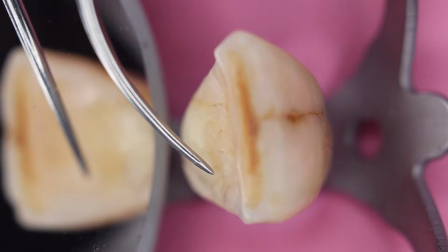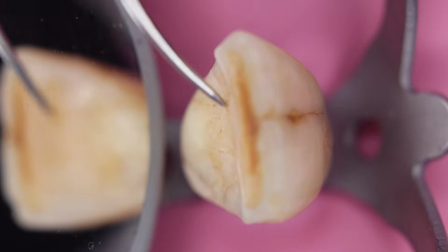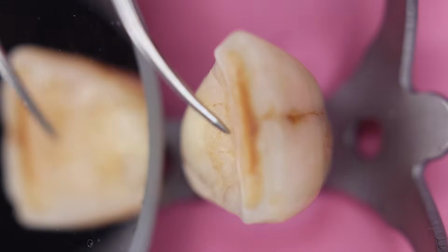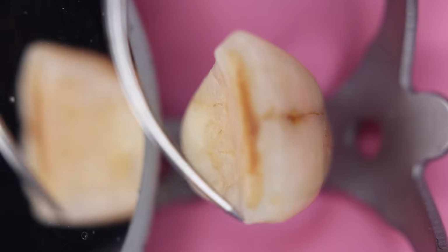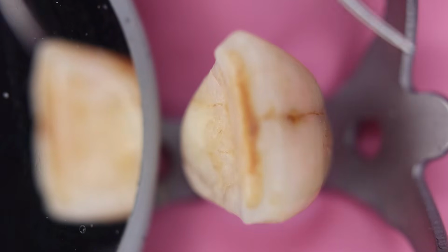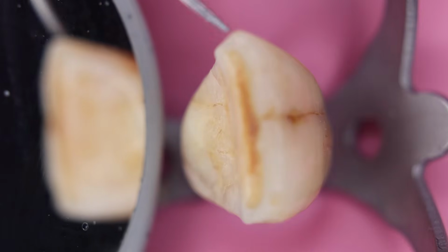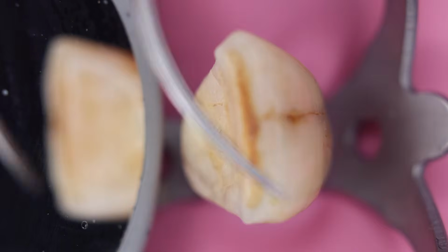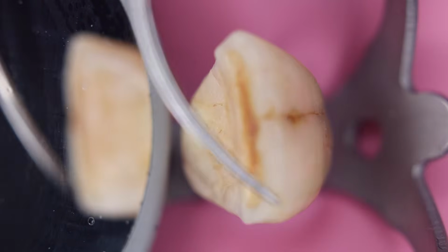Now, the third thing that you need to consider, when you are planning to prepare the access cavity, is the sides. When you see a sharp mesio-incisal angle, this is the mesial side and this is the distal side, which you can easily appreciate in the patient.